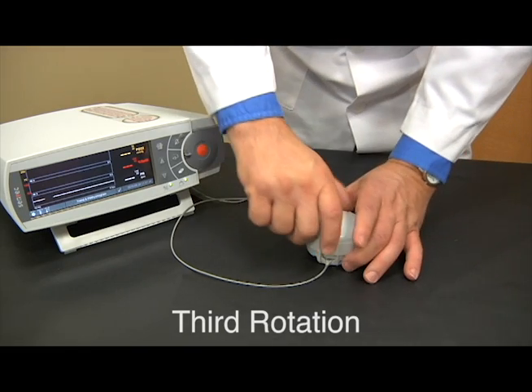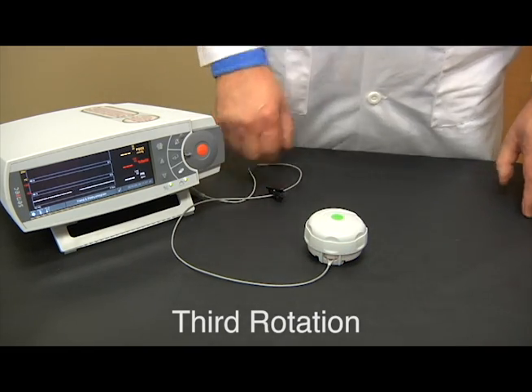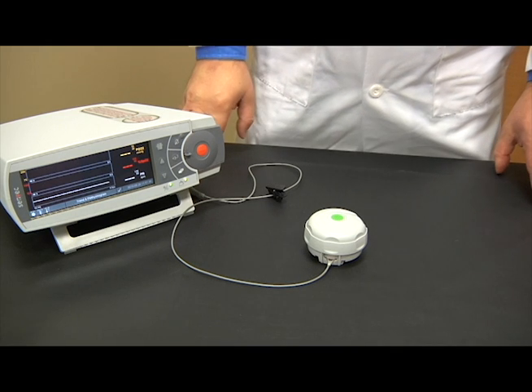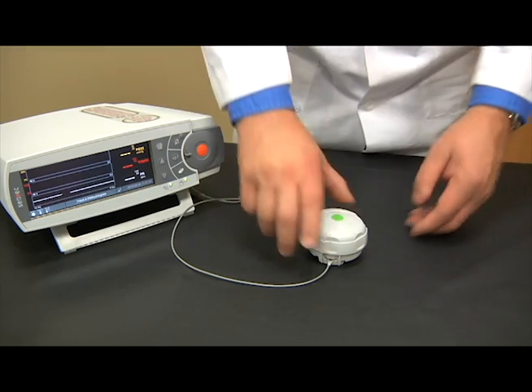Advance to the fourth station by holding the membrane changer as directed and turning clockwise one click. Push down firmly and listen for a series of three distinct sounds: click, click, pop. This is the new membrane being applied. Push down as firmly as possible to ensure proper application.